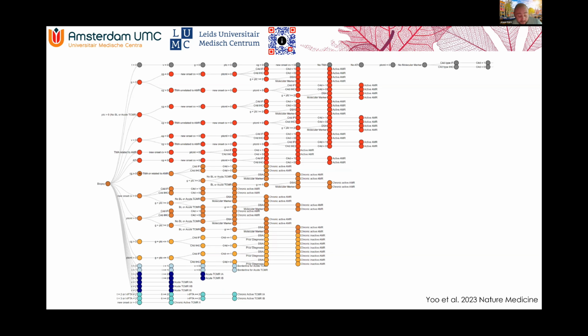Then if you have all these scores, you have to integrate them into a diagnosis. This is from a recent paper from the group in Paris. They nicely put it together in a decision tree. And you can see here that there are actually multiple combinations of these lesions that lead to exactly the same diagnosis. Of course, this biopsy can look completely different. So that's important to remember. So this is, in fact, a complex system. It's very prone to error. And that's actually the reason why they published this study, to try to automate this decision tree and help pathologists grade their kidney biopsies when they have already assessed the lesions. But it's a complex system. So both the lesions are quite complex as well as the aggregation of the lesions into a diagnosis.